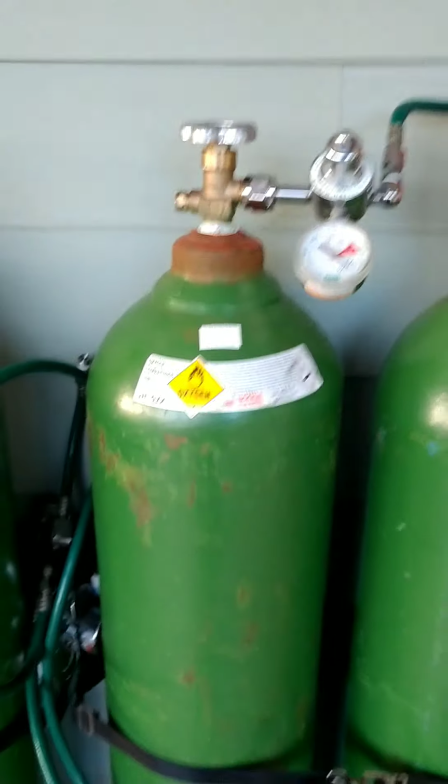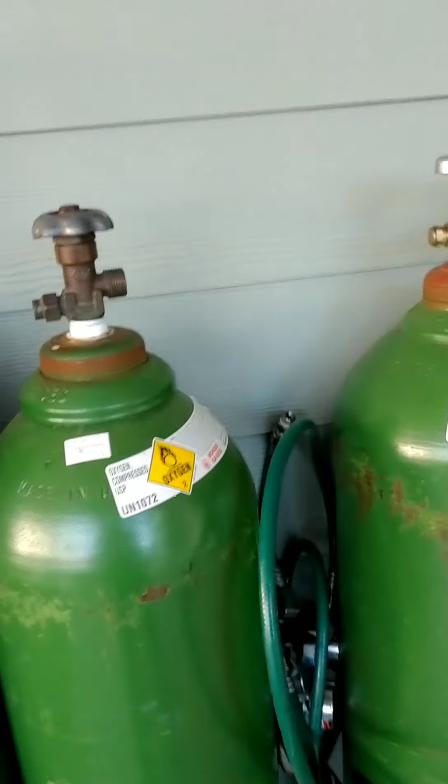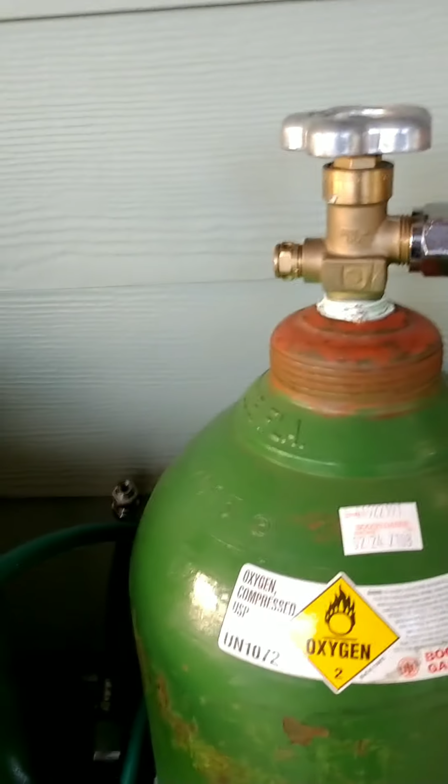Okay, so I'm going to go through the different parts of the anesthesia machine, the non-rebreathing system at our clinic. So right now I'm outside where we have our oxygen tanks hooked up. So we use the big H tanks. We also have our pressure reduction valve and line pressure gauge out here.